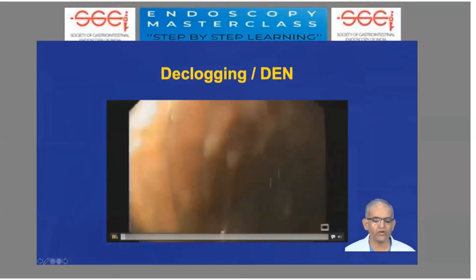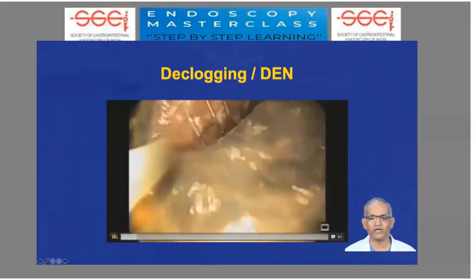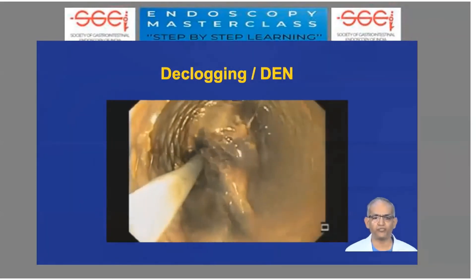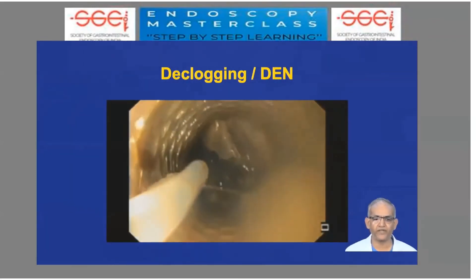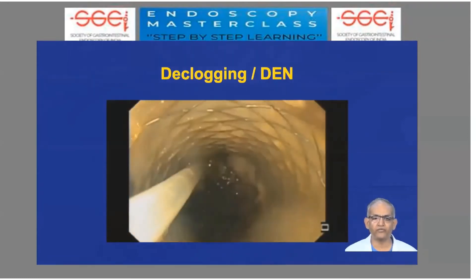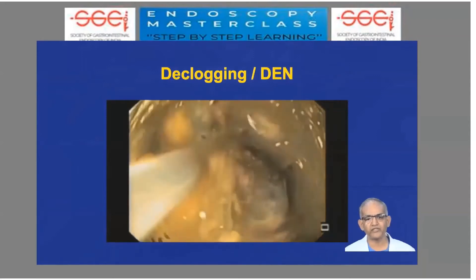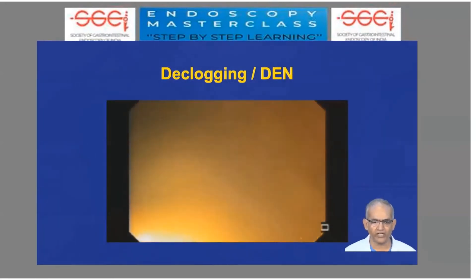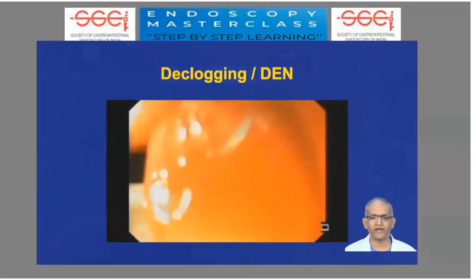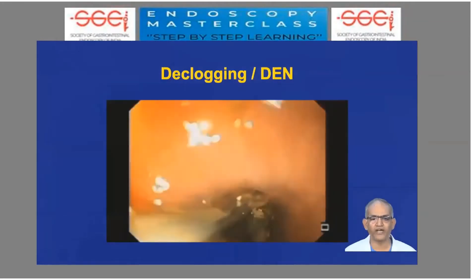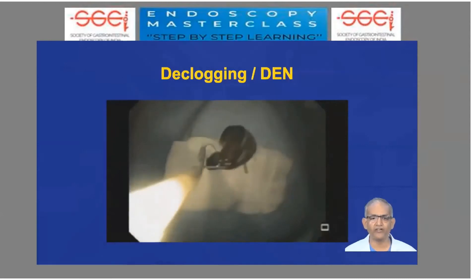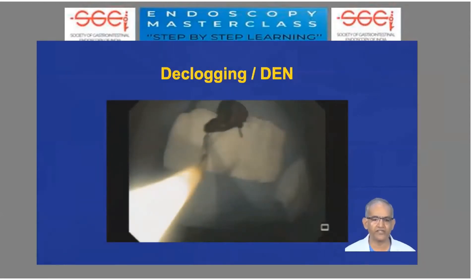Another example is where declogging is combined with necrosectomy. A similar-looking debris but a larger piece extending inside the cavity may not come out easily. You make adjustments, catch the largest chunk of tissue even if you have to push it out a little bit, then drag it out very gently — rotating the scope sometimes — so that it comes out through the stent. Often if a large chunk comes out, it also takes the metal stent with it.